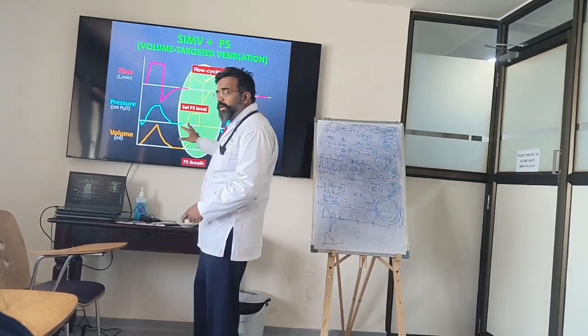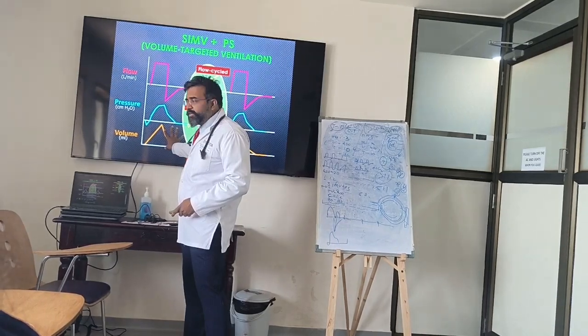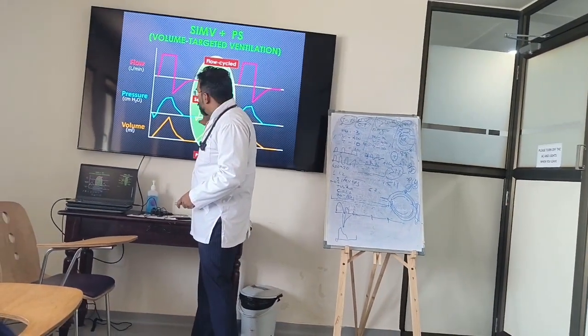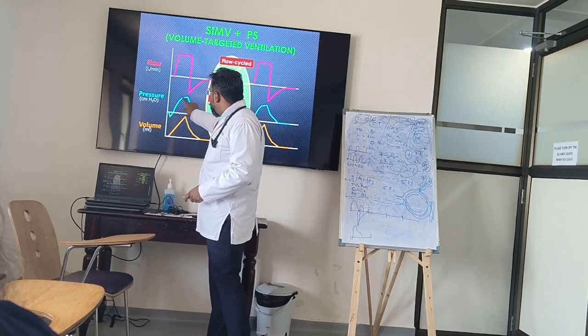So see, this is a diagrammatic presentation. So that's why you're finding it slightly difficult. Okay, but here what is happening is you are having a set pressure support. So this breath is pressure limited. Whereas here the volume is limited, it's the same. And the pressure is varying.